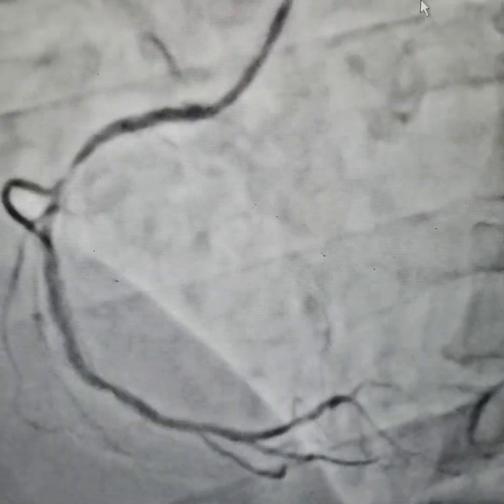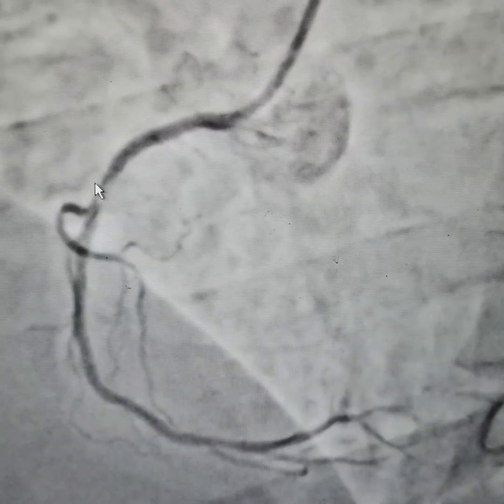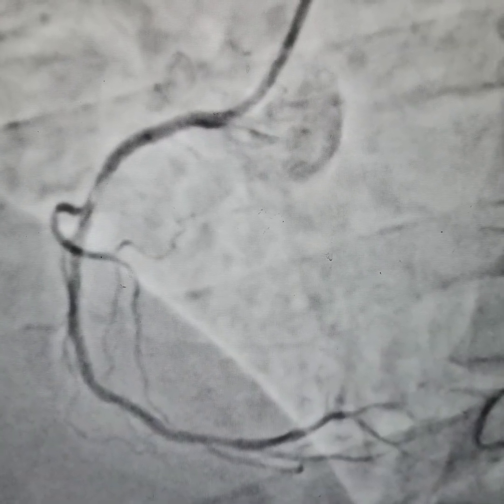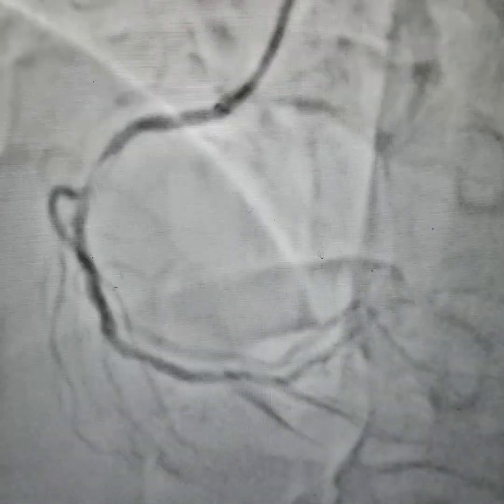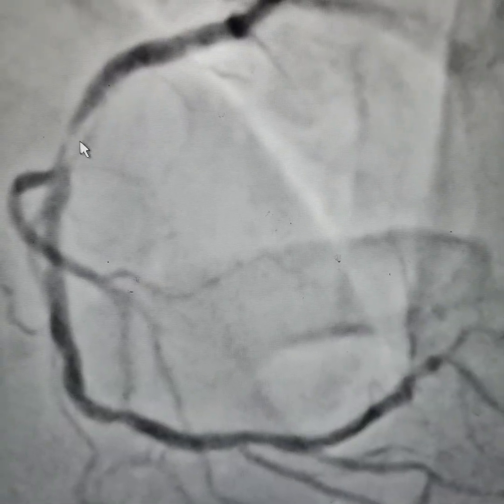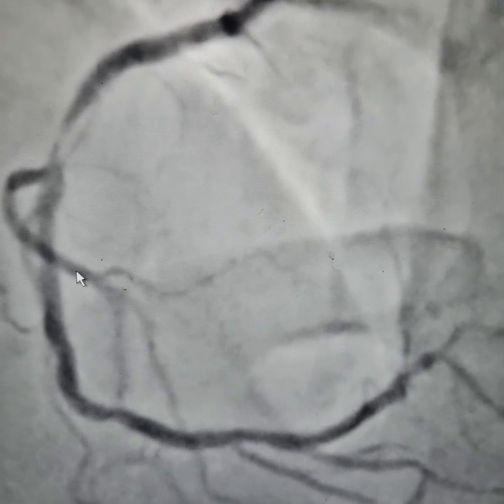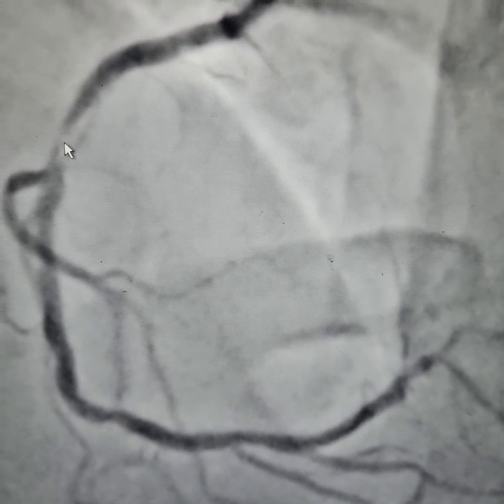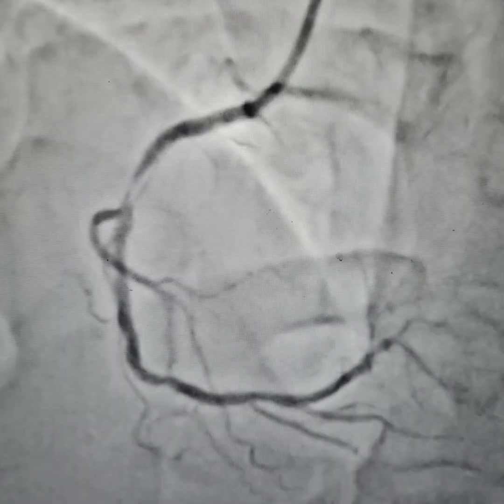In the case of inferior wall MI, you can see there is a tight stenosis — a 95-99% blockage. The RCA is totally diseased, but this portion is especially very much diseased. This is a great learning case.